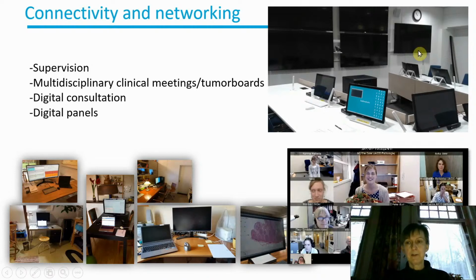In the upper right corner you see one of our tumor board rooms, where at this U-shaped table the specialists used to sit, like the surgeon, the pathologist, the radiologists, etc. Everybody has their own desktop to prepare the cases, but then we can share everything we like on these big screens.